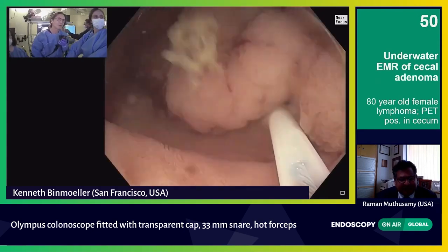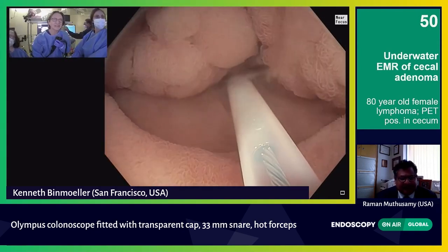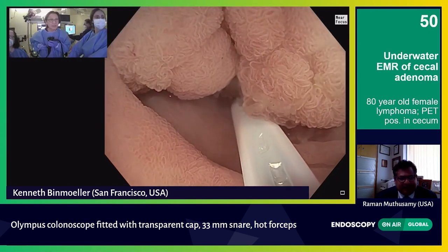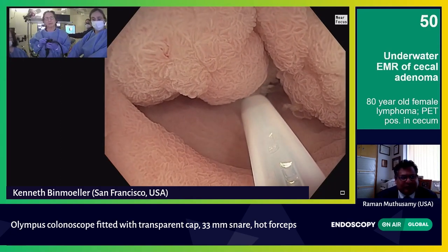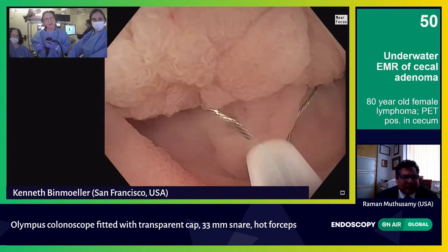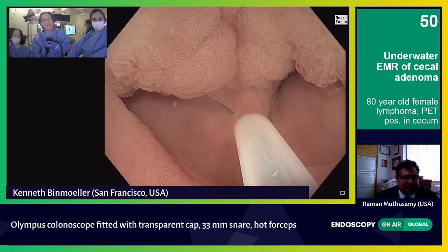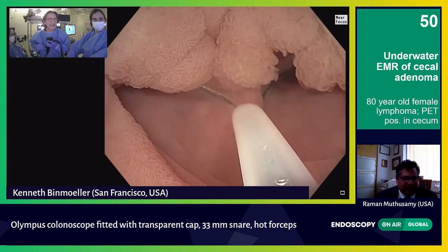I'm just going to turn on it. I've already got that right side. A lot of this — it's almost like optically it looked so big. It is big, of course. But the actual surface contact with the mucosa may be much less. I'm just pushing back and forth, trying to maximize the amount of adenoma that I can capture in the snare.